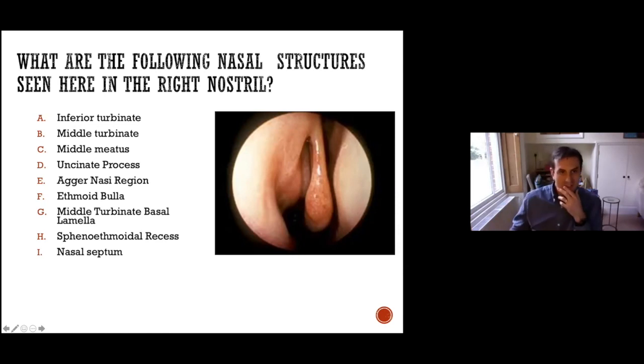So we've got A, B, C, and D. Any other takers? F and I, yeah.